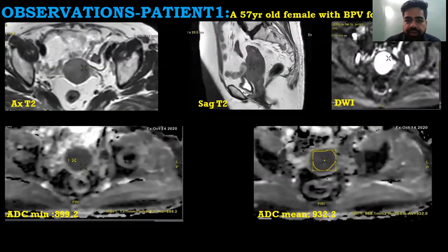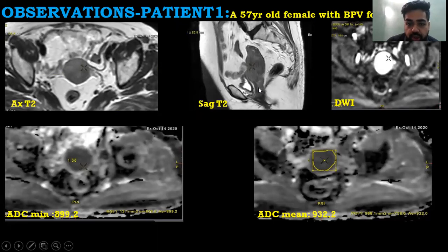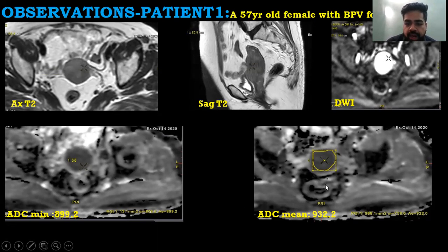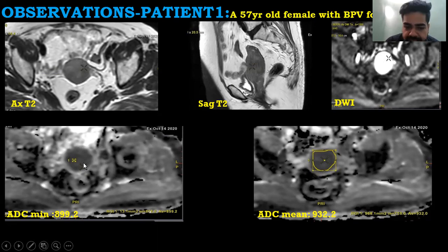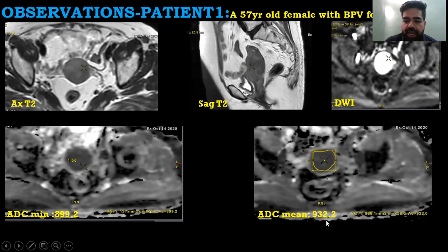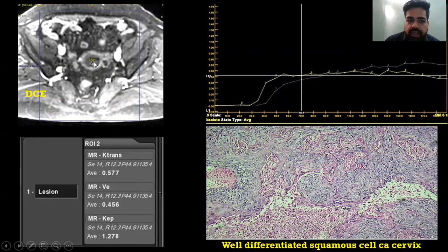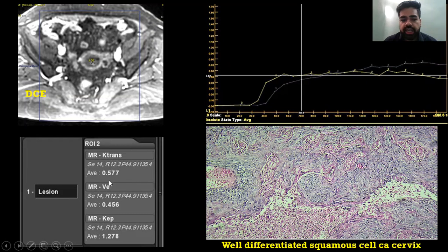Patient 1 was a 57-year-old female with per vaginal bleeding. Axial T2 and sagittal T2 showed a heterogeneous lesion involving the cervix, with DWI showing hyperintensity and hypointensity on ADC indicating restriction. ADC mean was calculated by drawing a manually drawn ROI encompassing the whole lesion, whereas ADC minimum was calculated by drawing an ROI of at least 10 mm² area over the lesion to find the minimum ADC value. ADC mean was 922 and ADC minimum was 899.2. On DCE, the lesion showed early enhancement compared to the myometrium; K-trans was 0.577. Histopathology showed a well-differentiated squamous cell carcinoma of the cervix.